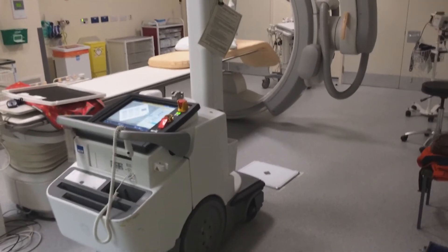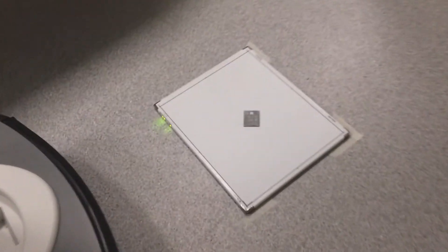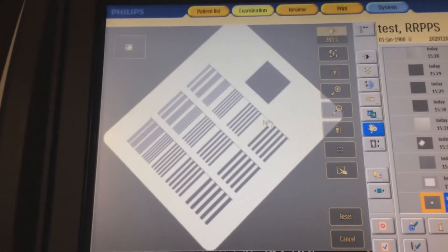I'm here today at a customer site and I'm testing one of their mobile x-ray machines. At the moment I'm running a whole bank of tests on image quality. You can see that I've got the machine set up here and I've just made an exposure on the image plates using this leads test object.